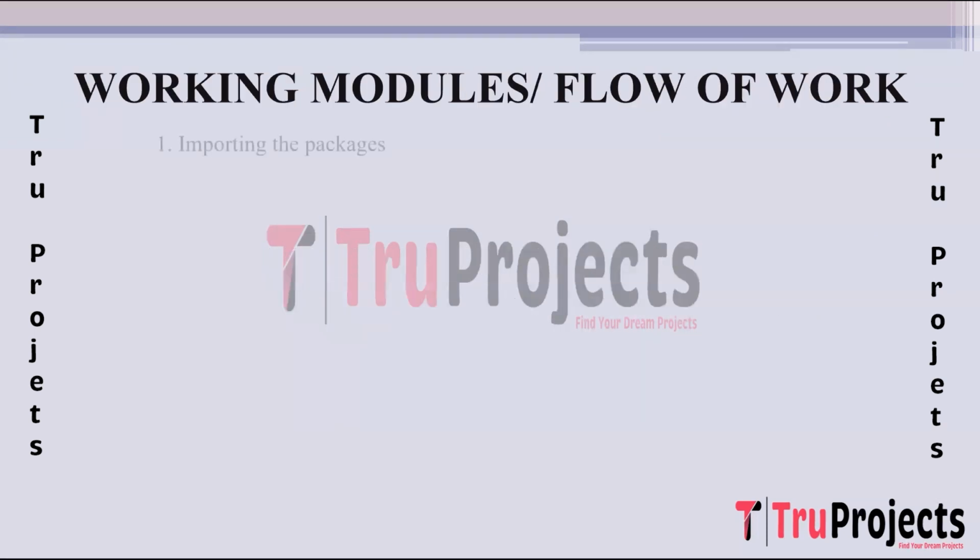Working modules or flow of work. To implement this project, we have designed the following modules. The first module is importing the packages. This step involves importing necessary libraries and packages in the chosen programming environment. This usually includes libraries for deep learning frameworks such as TensorFlow or PyTorch, data manipulation like Pandas or NumPy, and image processing such as OpenCV.